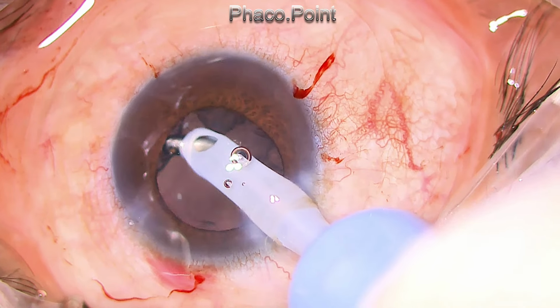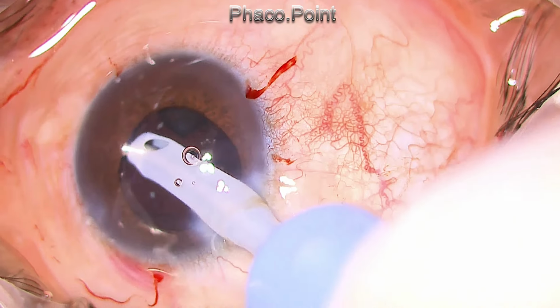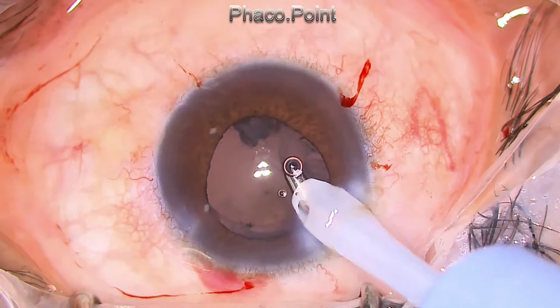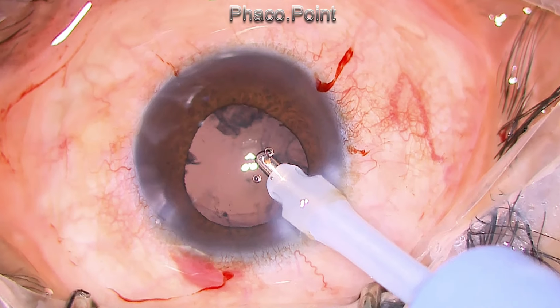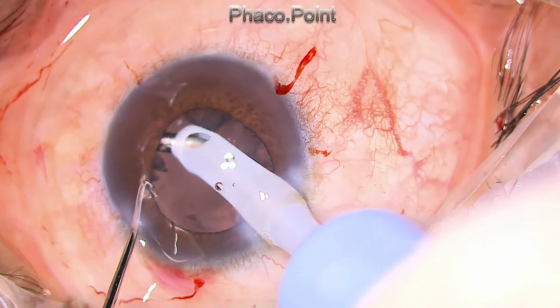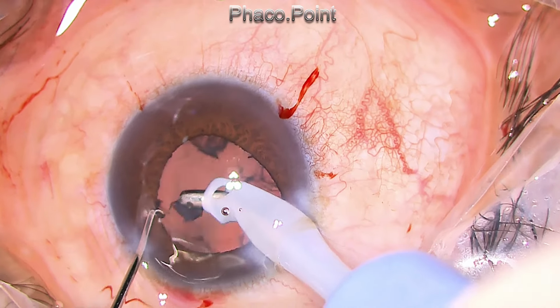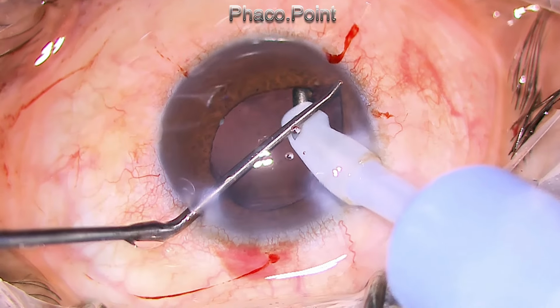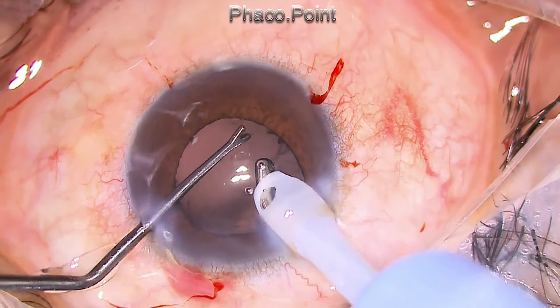The removal of the cortex was also a little bit of a challenge because the cortical cleavage hydrodissection did not happen too well. I must not have got into the right plane, and the cortex was sticking onto the posterior capsule. The presence of a CTR also prevented the easy and facile removal of this cortex, but eventually I got all the cortex out of the capsular bag.